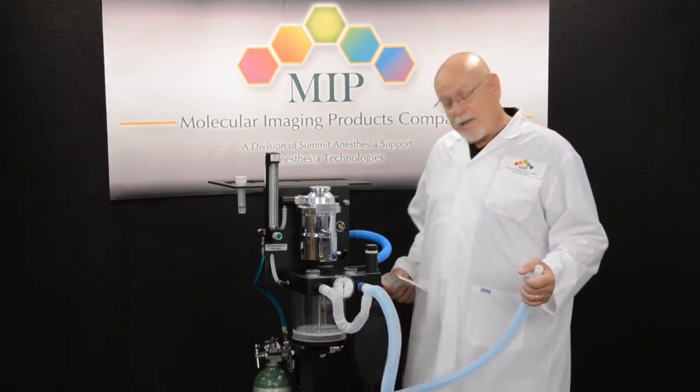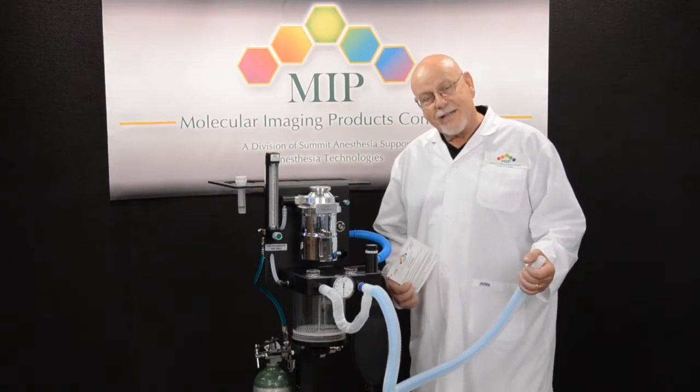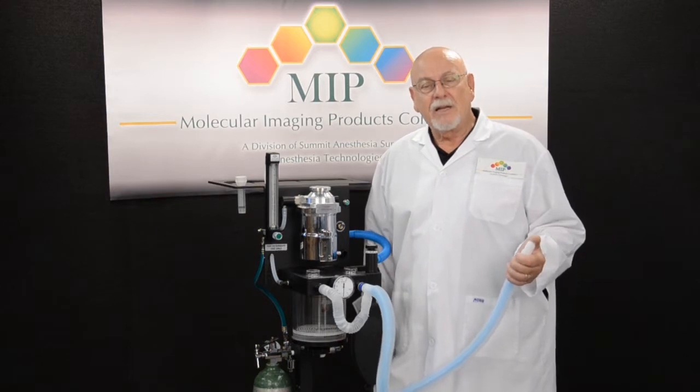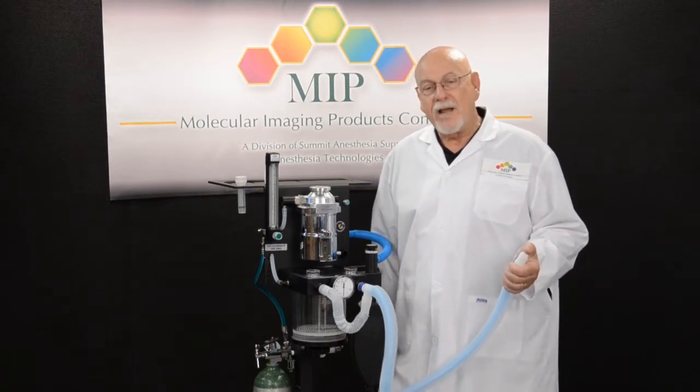Each one of you can receive one of these 10-second test cards to hang on your anesthesia device simply by giving Molecular Imaging Products a call on our 800 number.